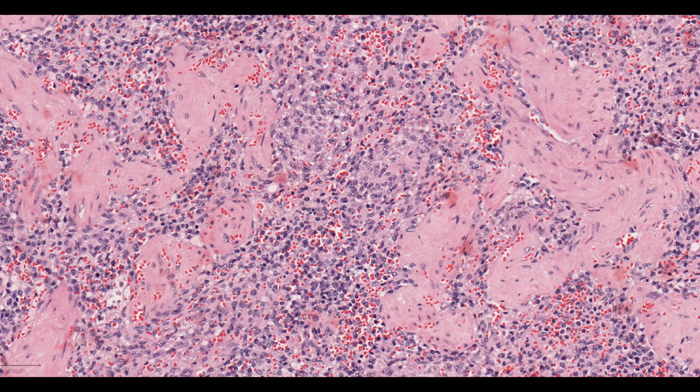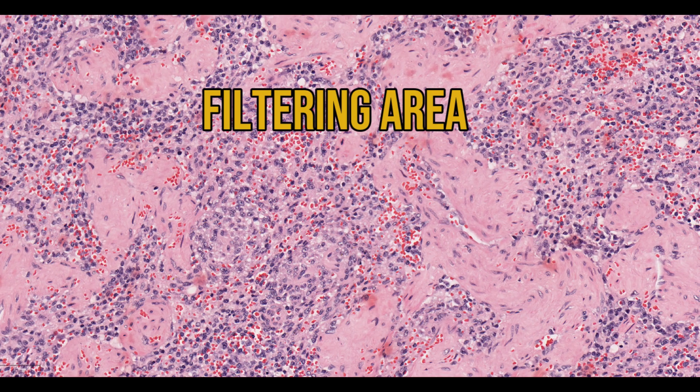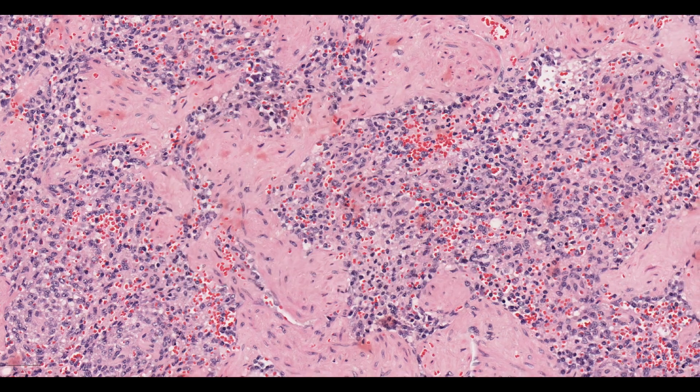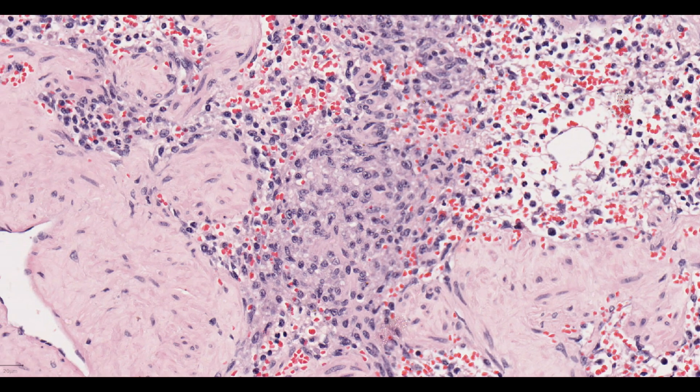According to the textbooks, the red pulp itself can be split into three functional areas: filtering areas, non-filtering areas, and perilymphoid zones. Generally, the red pulp looks like a bit of a mess, but sometimes you can see hints of the filtering areas.